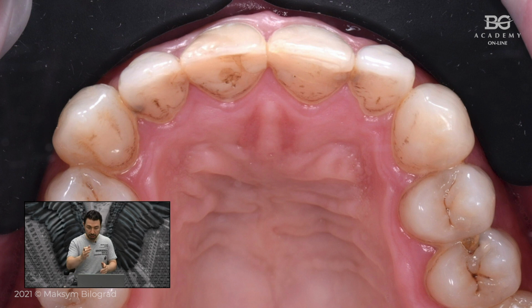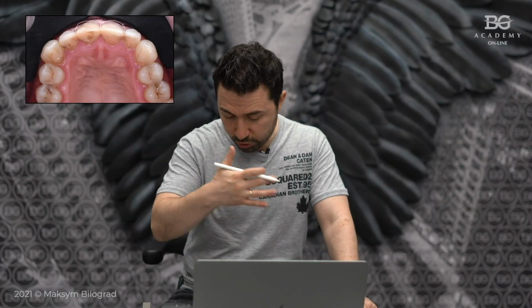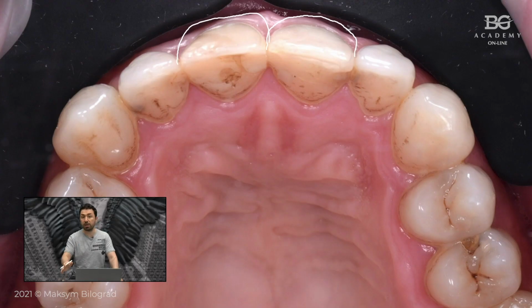Yes, we can. In his case, let's take a look. His central incisors are straight, plain, flat. So basically I can add. Let's just imagine I will take my pencil or stylus and we can just add. I don't know how much we can add here. Just let us assume. By the way, this case is pretty old.